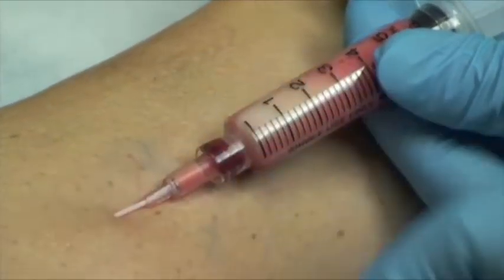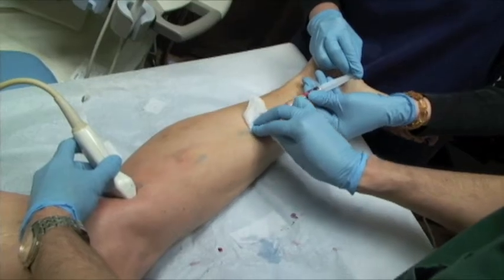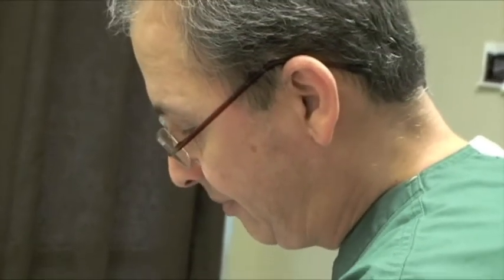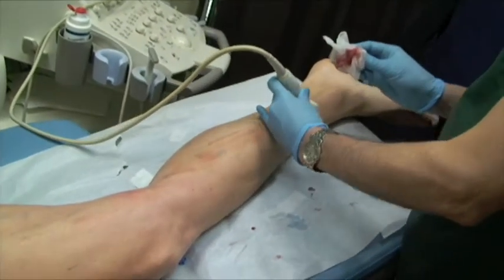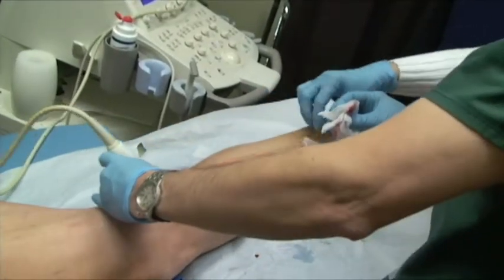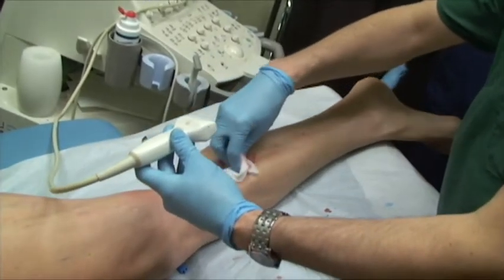I pull this catheter out too and move it toward the other one. Practically, we should have removed about 90% of the injected medicine and air — that was unnecessary medicine and air to be left in the leg and cause problems like pain and increase the risk of DVT. So this should be a safer method.